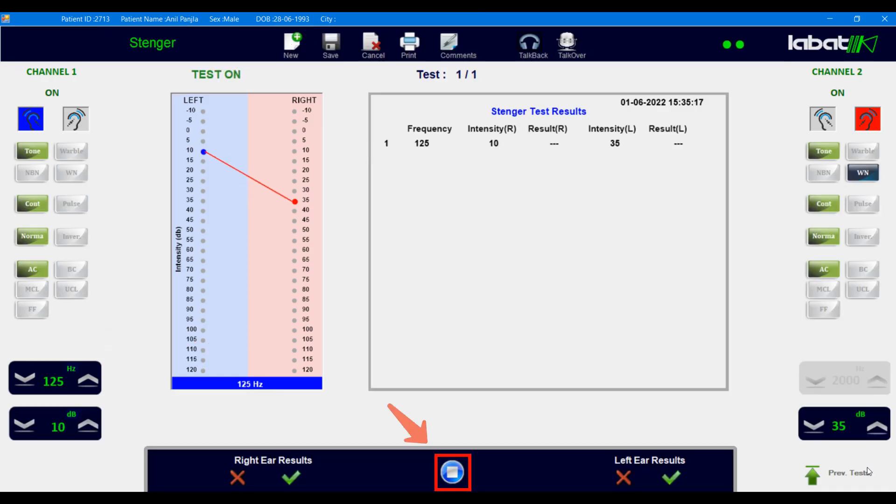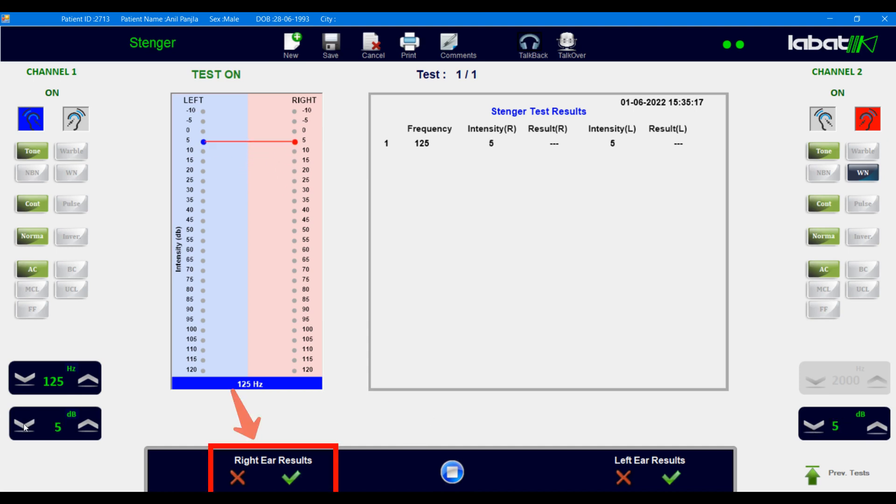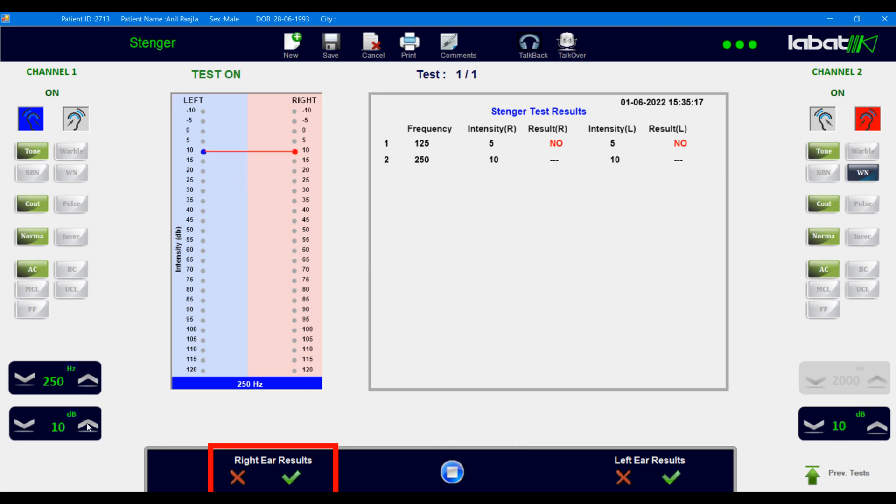Then press Play to start the test. On right ear result, click on Yes if patient hears the stimulus, or click No if patient cannot able to hear the stimulus.